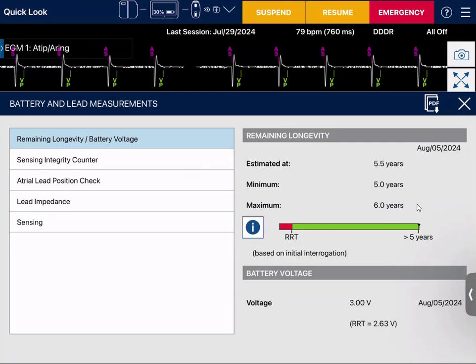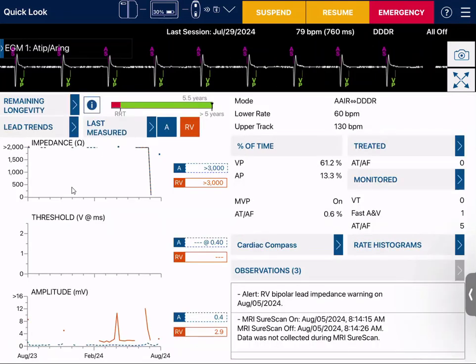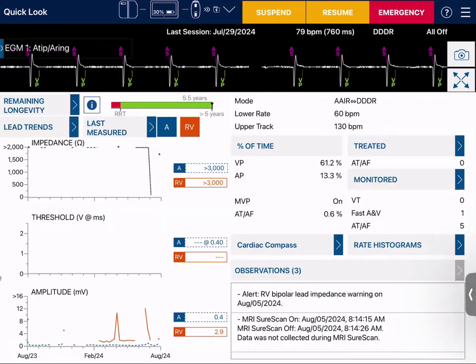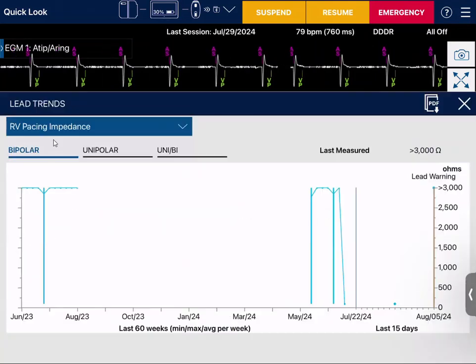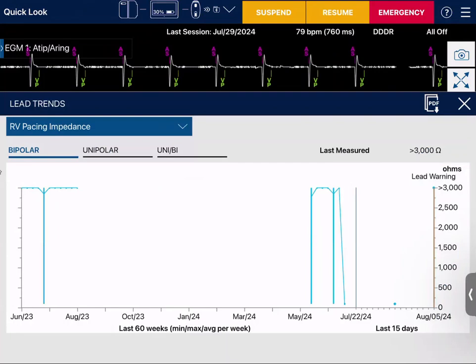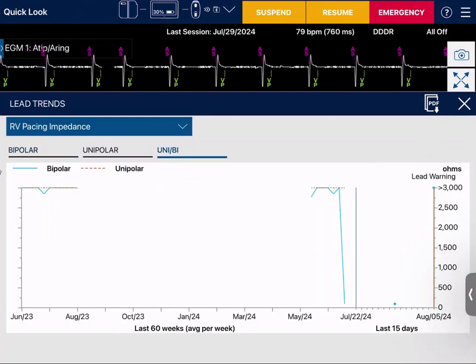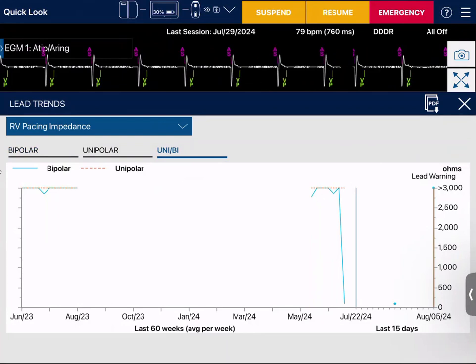Next, I'm going to look at my lead impedance trending on my quick look. I can also click where it says lead trend to pull up my impedance trends. I want them to be steady and stable over time — they should have a straight line coming across in both your bipolar and unipolar trending.